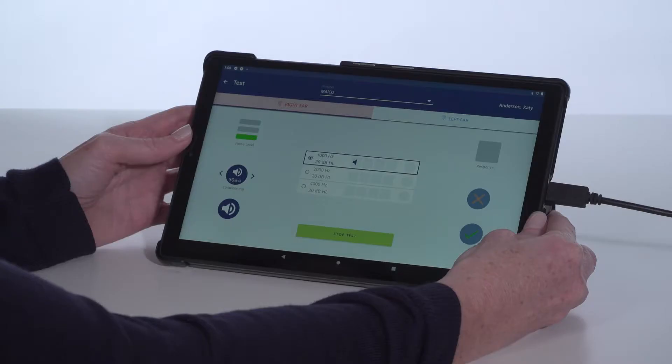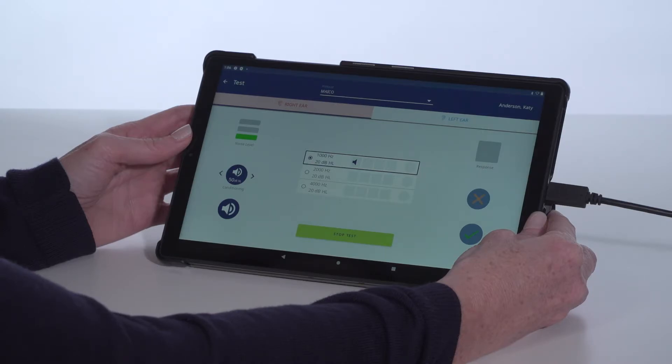Adjust the headband so the headphones are centered over the ear canal. The test screen will only display the frequencies and screening levels defined by the protocol.